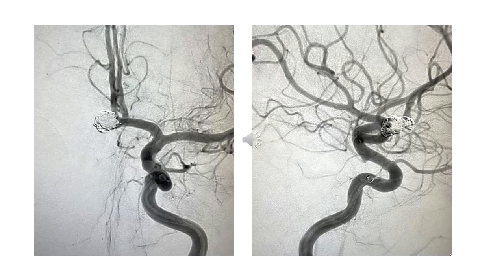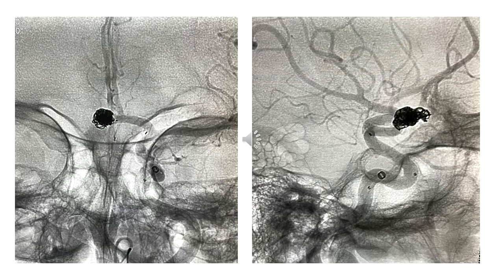The stent is open. All the arteries and the bifurcation is open. Unsubtracted view, we can see there is dense coil at the base also. We can see the stent markers. The Solitaire stent is not that well visible. However, the markers will be seen, and we can see that the A2s and the A1 as well as the neck of the aneurysm is patent.